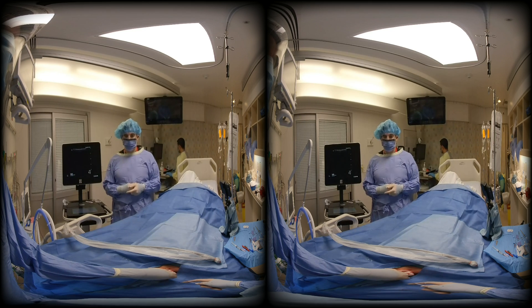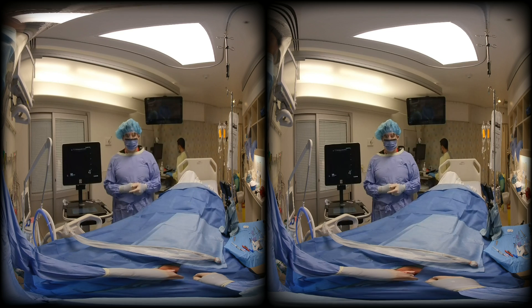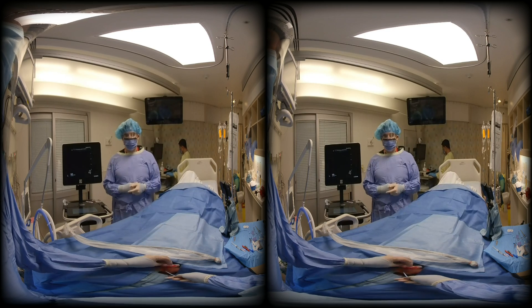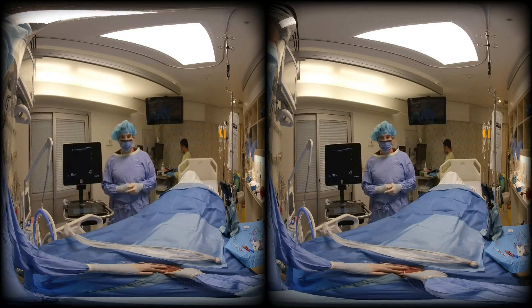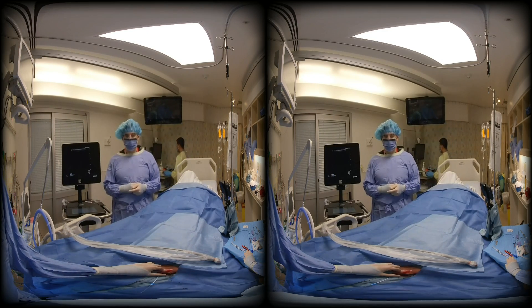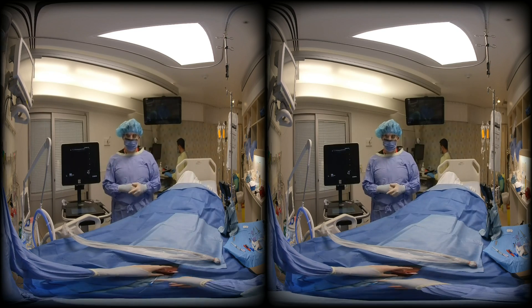You are doing a great job at controlling that wire to prevent losing it at any time. Because you have verified wire placement with ultrasound, you can now put in the introducer dilator. This will go in occasionally with some resistance — you may have to apply sustained pressure and even some corkscrew-type motions. Note that the dilator doesn't have to go all the way in, just enough to dilate the track from skin to vessel.